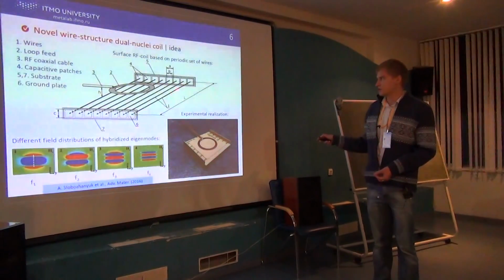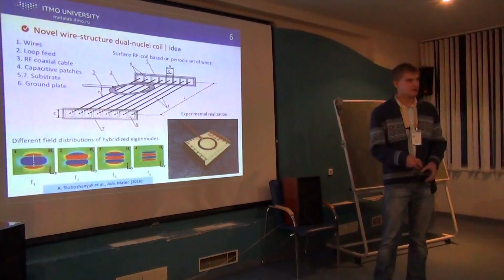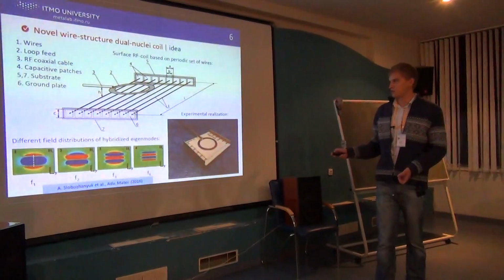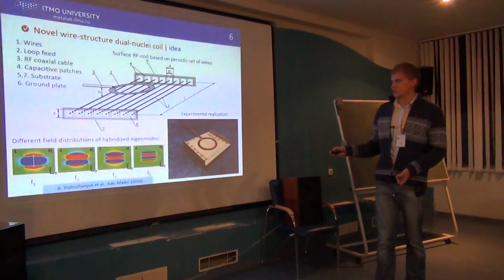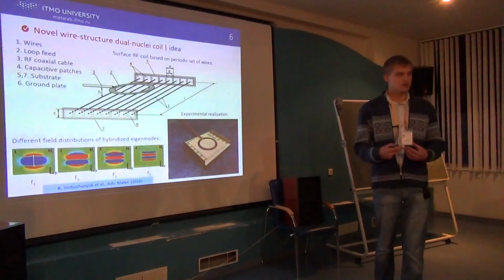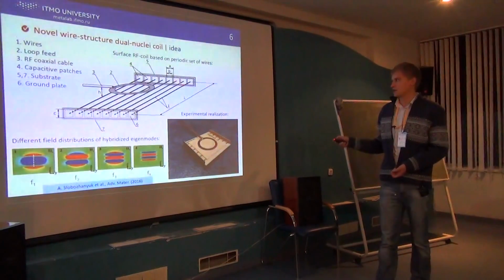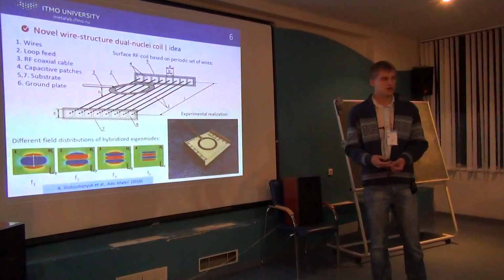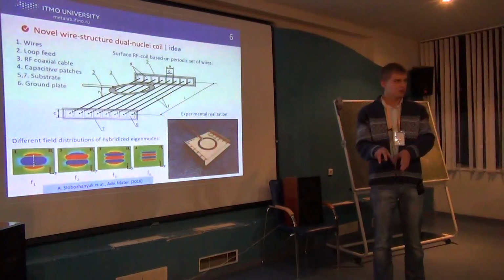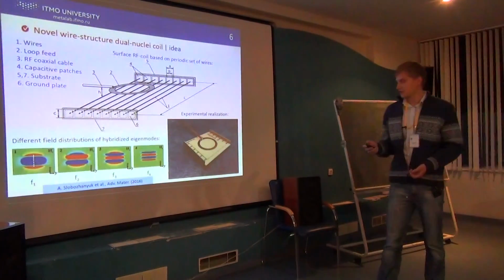We take the structure of several parallel wires, and since the size inside the bore is limited, we need to make these wires very small. They cannot be half wavelengths. For this purpose, we load them to this structure, periodic structure of metal square patches, which behave as capacity. And with these patches, this can be resonating at 300 megahertz approximately, with the size of approximately 5 or 6 centimeters, which you can place inside the bore of 9 centimeters in diameter. The preclinical bore, for example, a Bruker machine. So there is no problem.